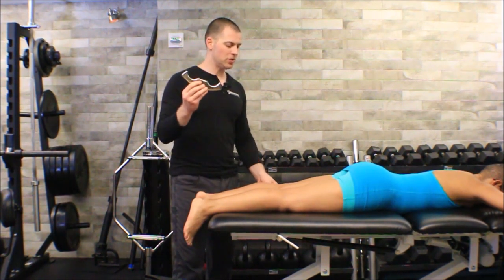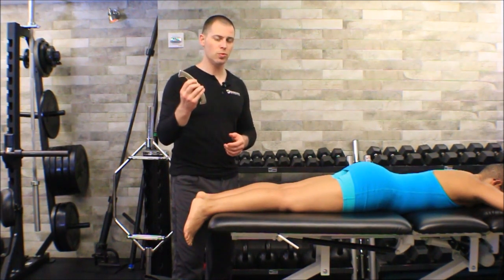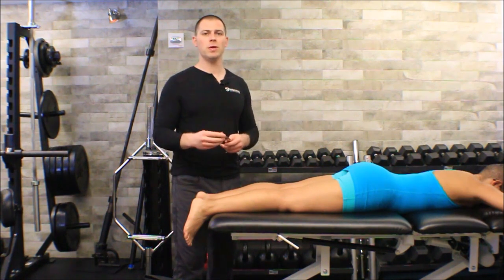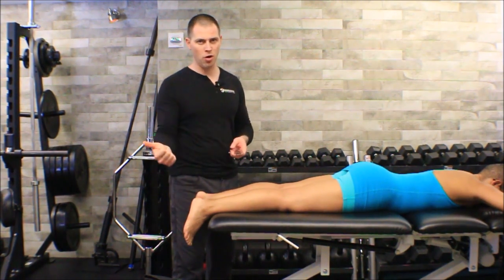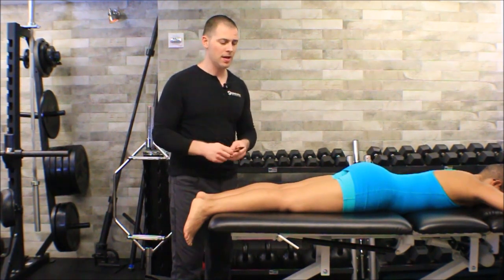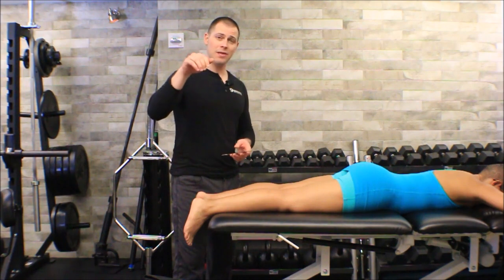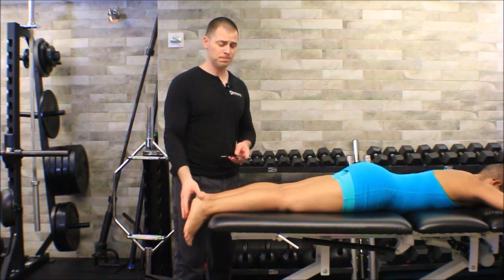What happens to fascia when we stretch it or stress it with an IASTM tool is not the same thing that happens when we stretch or release a muscle. In fact, there's some research to point to repetitive stretching leading to something called strain hardening, which actually increases the stiffness of fascial tissue. And if I think about increased stiffness, that could be a good thing for my plantar fascia in those who have lower extremity and particularly foot dysfunction.